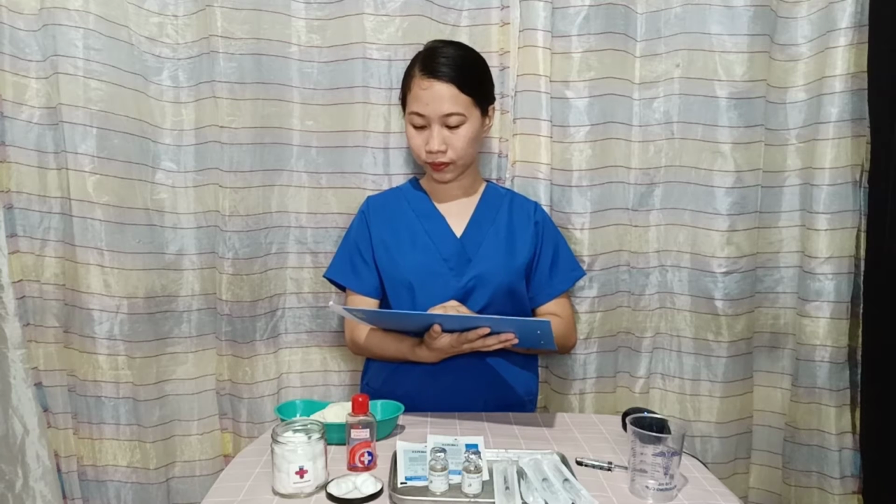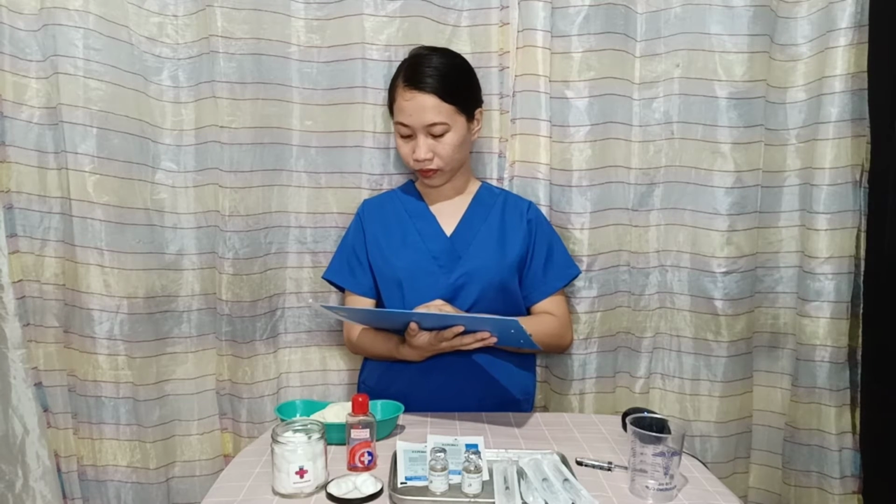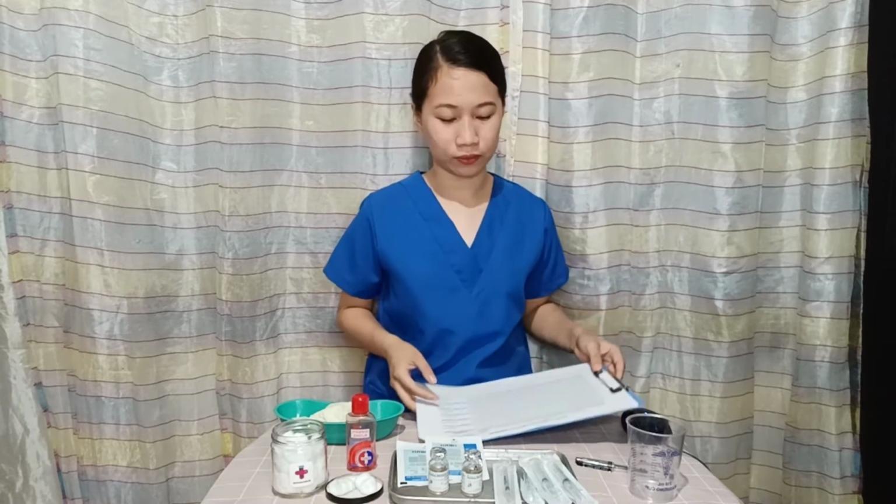Next, check the MAR. Check the label on the medication carefully against the MAR to make sure that the correct medication is being prepared. Then, follow the 3 checks for administering medication. Read the label on the medication when it is taken from the medication cart, before withdrawing the medication, and after withdrawing the medication. Next, organize the equipment.